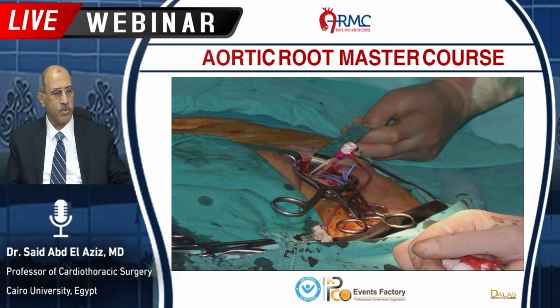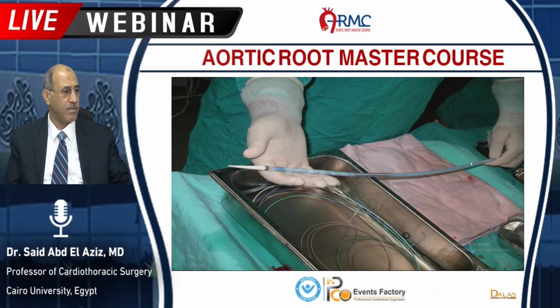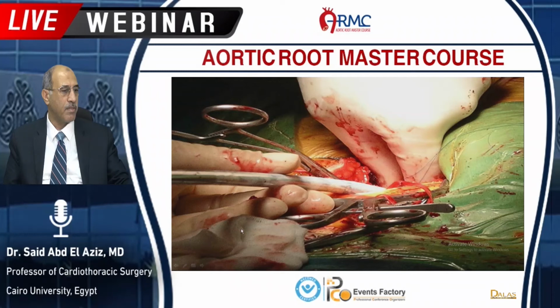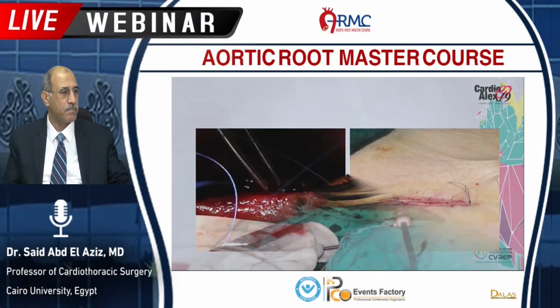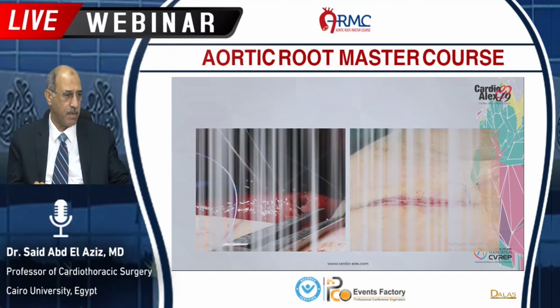Over it we will introduce the wires, and this is the picture of the stent before introduction. Here we are introducing the stent through the femoral artery. This is the stent inside the femoral artery. This is another picture of it. And after we finish the procedure, we just close the femoral artery and the skin.